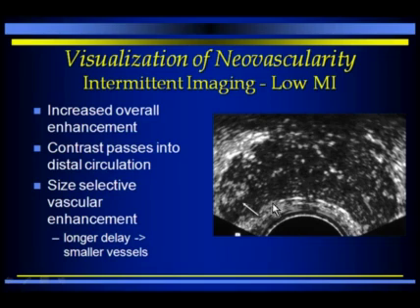So there are multiple different ways of visualizing ultrasound contrast agents. I'll show you in a little bit some of the color and power Doppler methods, but we actually prefer to use some of the grayscale methods. And the grayscale methods use harmonic imaging, as we just talked about before, so you can distinguish what's coming from the contrast by the frequency of the sound that's returning. And there are different ways of doing that harmonic imaging, but basically, once we have the grayscale image, we actually see the areas of increased vascularity as brighter because the contrast agent tends to cause increased reflectivity.